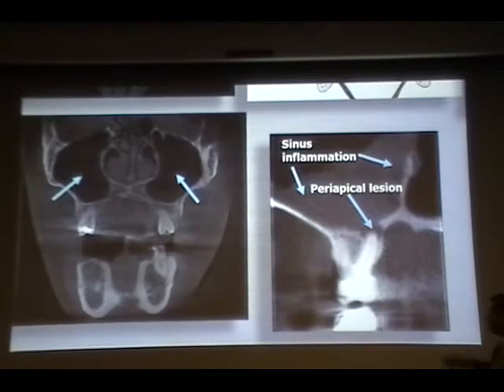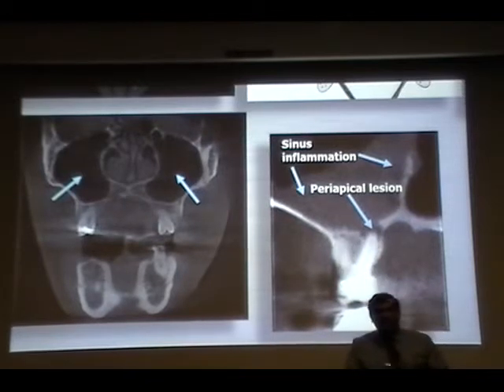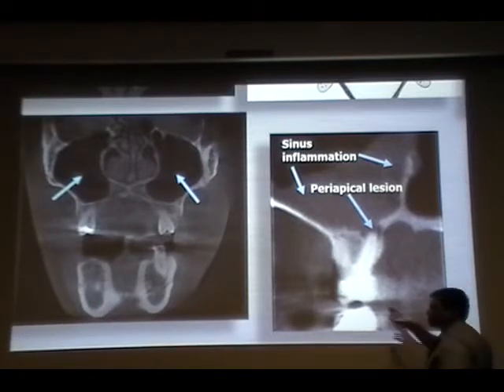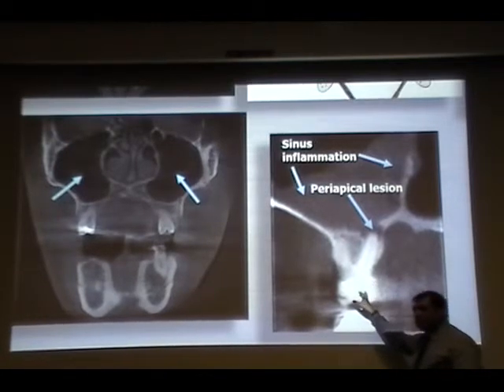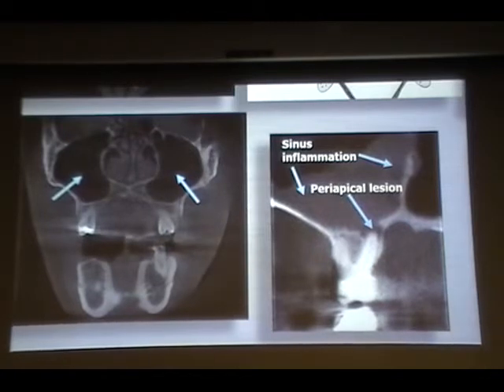Generally, you're going to see the lamina dura surrounding that. There is a breach of lamina dura there, and there is an extension into the maxillary sinus. So as a dentist, you are responsible for treating this tooth. The treatment here is either extraction or endodontic treatment, or extraction and then an implant. Yeah, those are some of the choices.